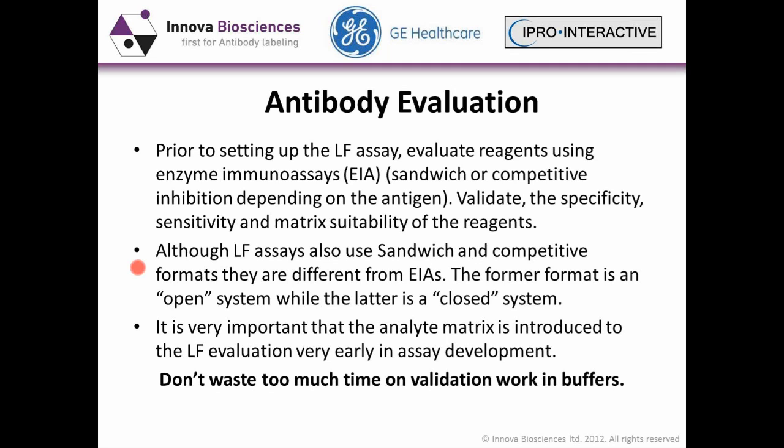But one has to keep in mind that there is not a direct correlation between the lab-based assay and the lateral flow. The lab-based assay, especially those done in microtiter plates, I would define as assays in a closed system, because you have everything there in the microtiter well. While with the lateral flow assays, it's what I term an open system, because you have a continuous flow of reagents on top of the capture molecule and so on. So it is not a direct follow-up or correlation between the lab test and the lateral flow. One needs to keep that in mind.